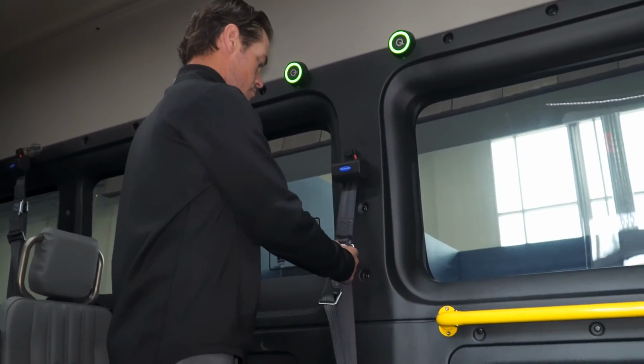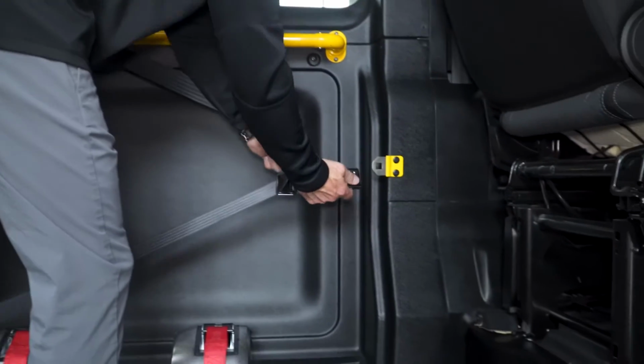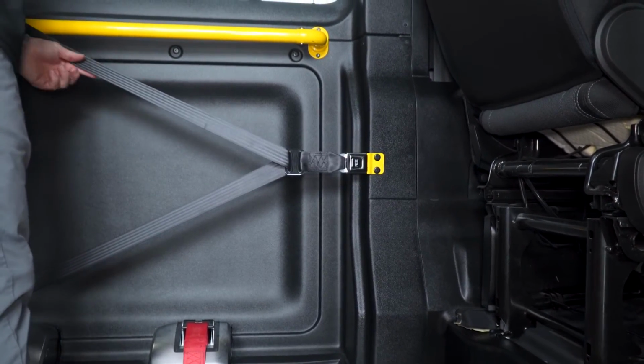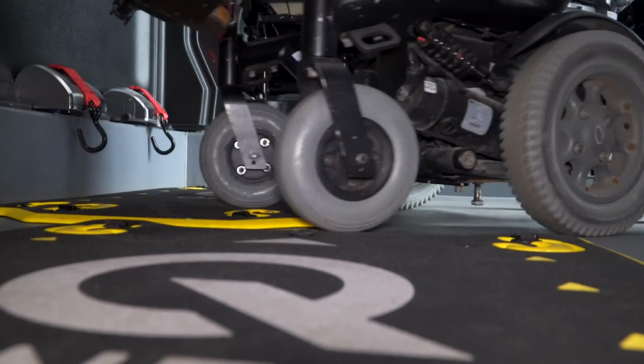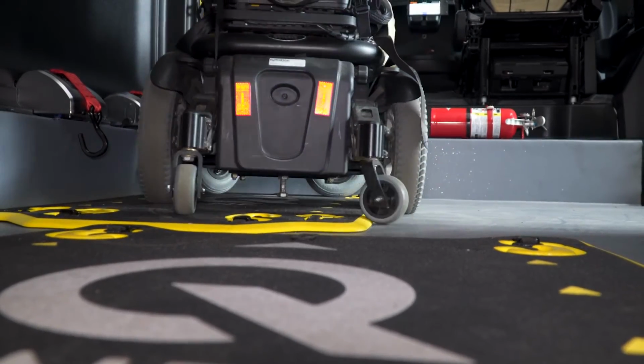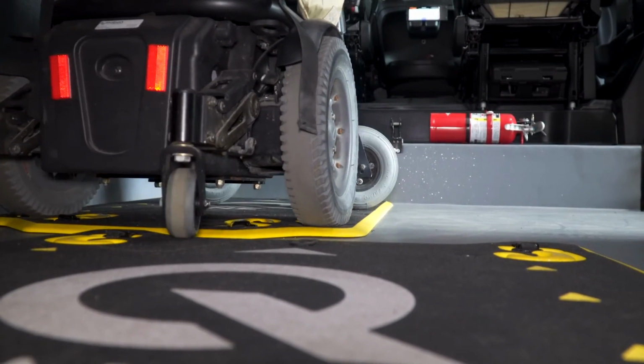Prior to loading the passenger into the vehicle, the operator prepares the occupant securement for use by removing it from stowage and attaching the shoulder belt and the wall side portion of the lap belt to a connector on the vehicle wall. When positioning the passenger in the securement location, the recessed securements provide more clear floor space and eliminate the tripping hazard that traditional retractors present.